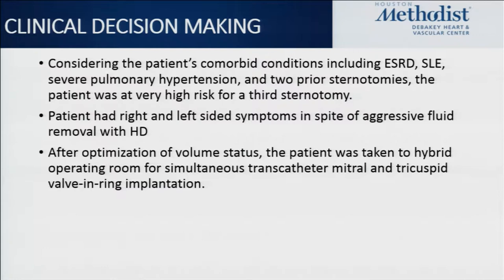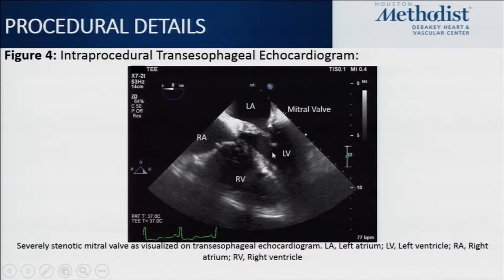Here is the periprocedural TEE. You'll note how severely thickened these valve leaflets are. Another thing to note is the difficulty of intraprocedural tricuspid imaging — the tricuspid is a very anterior structure, and especially with prosthetic material or calcification, it can be very difficult to get clear images on TEE. Here is a 3D reconstruction showing a very limited diastolic orifice area.